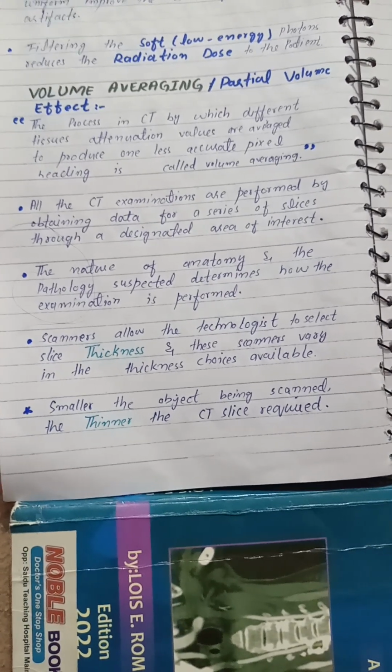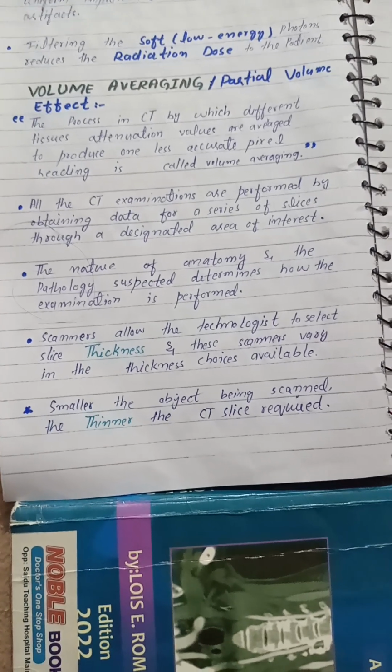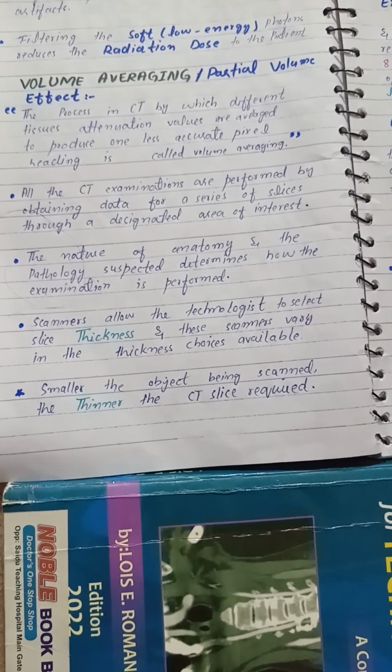Scanners allow the technologist to select slice thickness, and these scanners vary in the thickness choices available. The smaller the object being scanned, the thinner the CT slice required.